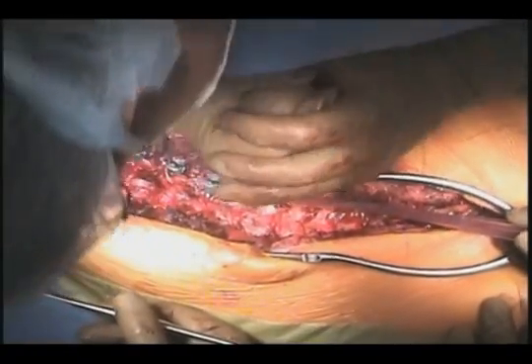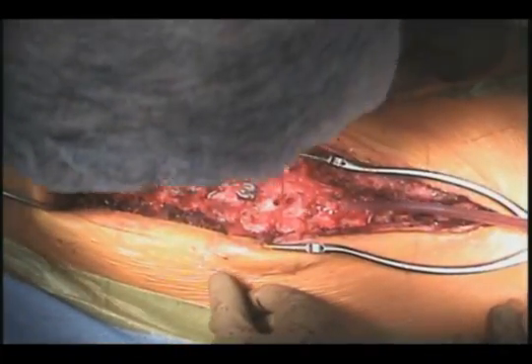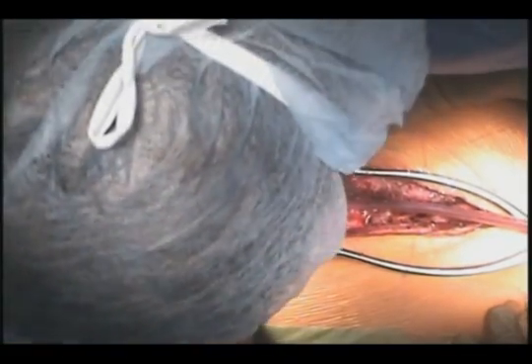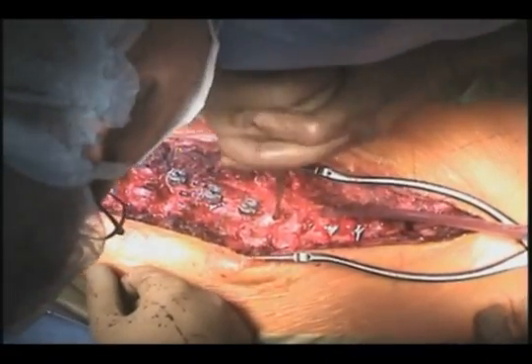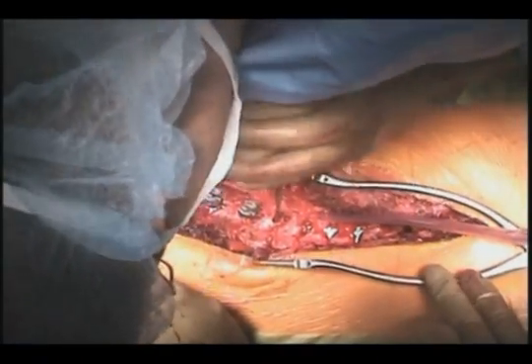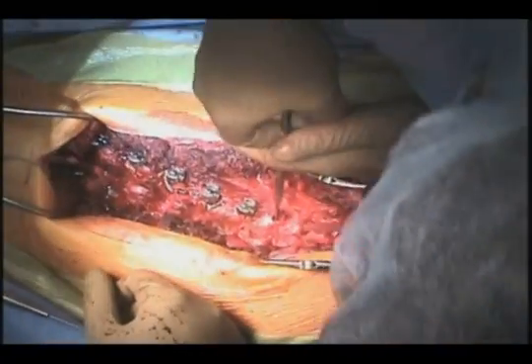There are some situations, particularly here at the apex on the concave side of the scoliosis, where the pedicles are very narrowed and sclerotic, and that's due to the long-standing nature of this deformity, and the pedicles become dysplastic. So in some cases it may be difficult to enter the pedicle with either a drill or even with the probe, but here, because I was having some difficulty entering, I used the more rigid probe that is allowing me to get into the pedicle.